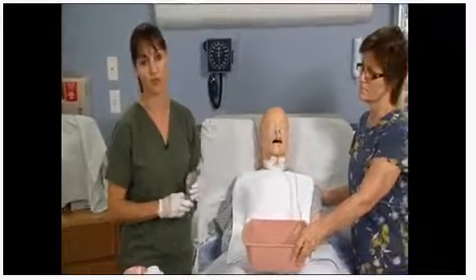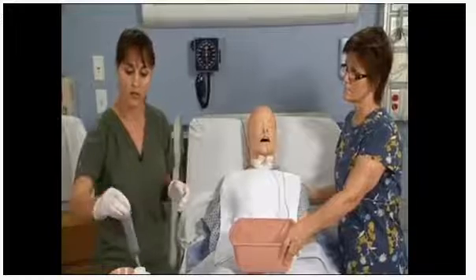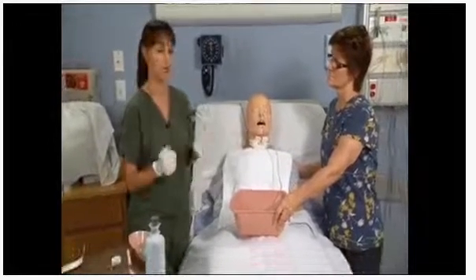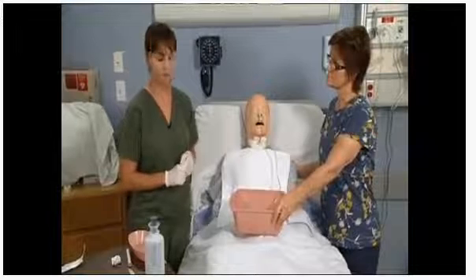And when you test the pH strip, you want it to be below 5. That tells you that you're acidic and you're in the right place. Also, check your agency policy to see. Some places may want you to do a chest x-ray to verify for placement. So again, it's very important that you know how the agency verifies for placement.